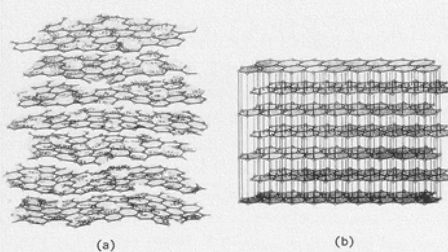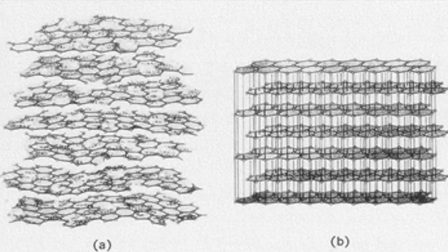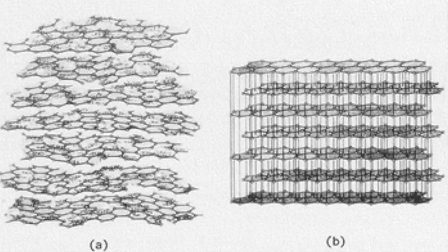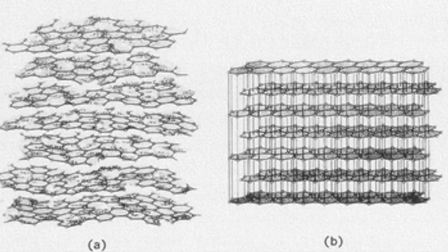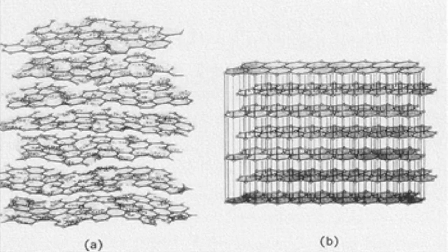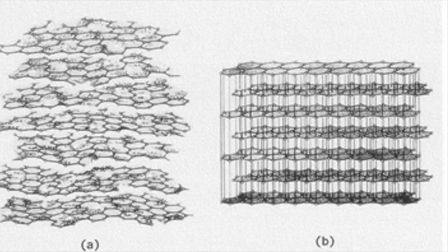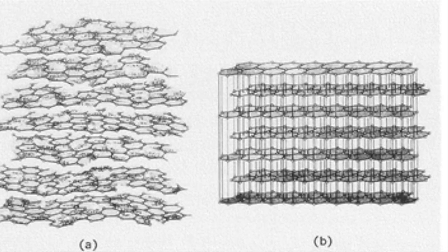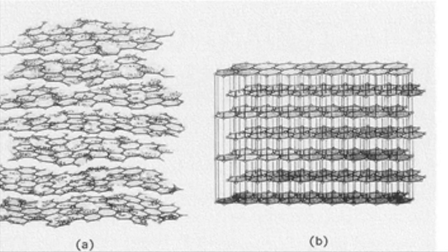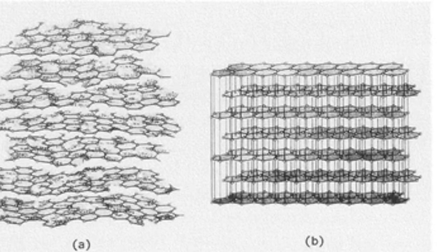Furthermore, mechanical heart valves that are coated with this material are significantly less likely to contribute to clotting and also exhibit longer lifespans. Other significant properties of pyrolytic carbon include its anisotropy, lack of porosity, thermal conductivity, and diamagnetism. Thus, it serves as a powerful source of reinforcement in the face of the high levels of repeated stress that heart valves are typically subjected to, which, quantitatively speaking, is approximately an average of 7.2 newtons per unit area for each heartbeat.